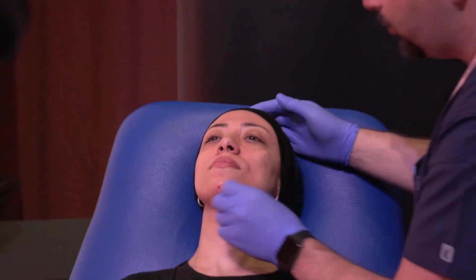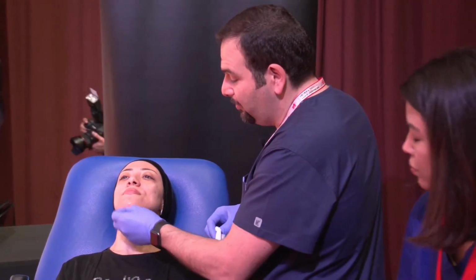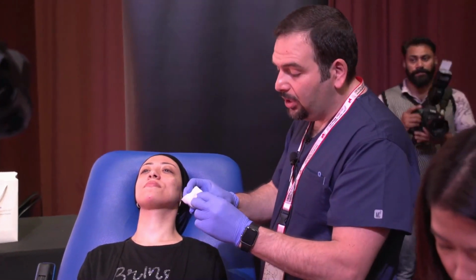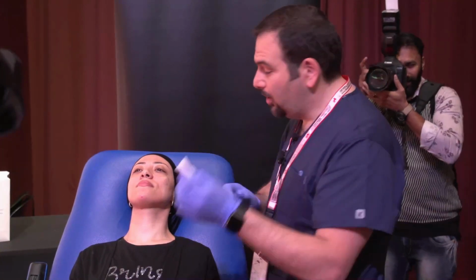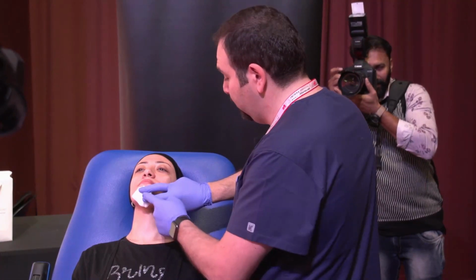It's important to know that when you use an alcohol swab to eliminate infection, every time you swipe, bleeding will come more. So what I can do, I put an alcohol swab on my gauze and apply pressure. You can ask the patient or the nurse to apply pressure in the area.